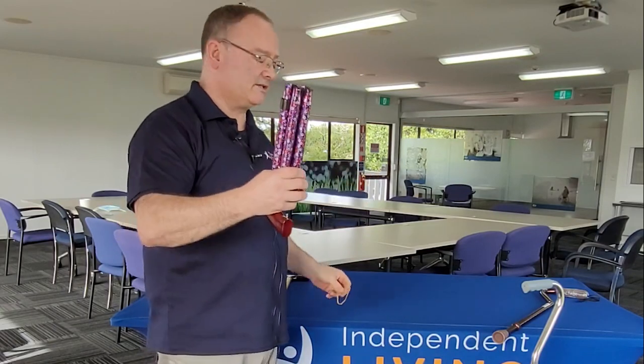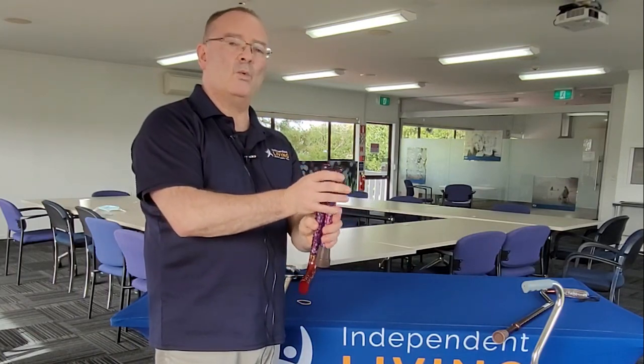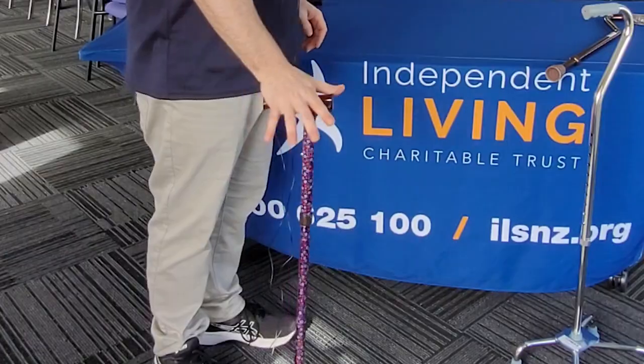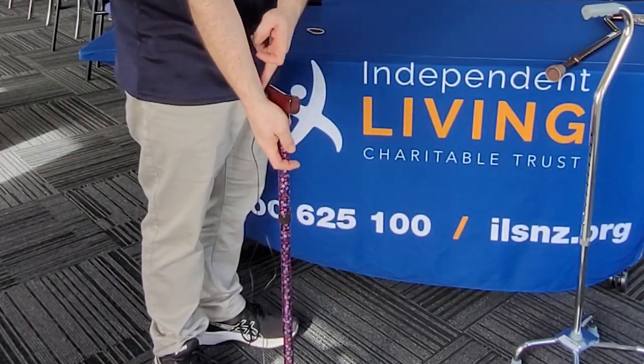We also have a range of folding walking sticks. These are quite handy if you need a spare stick, if you want a stick in the car, or if you are going away and you want to put a stick in your luggage. It flicks out and it's immediately ready to go, already sized to you.